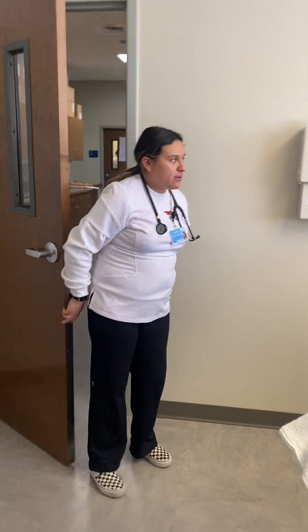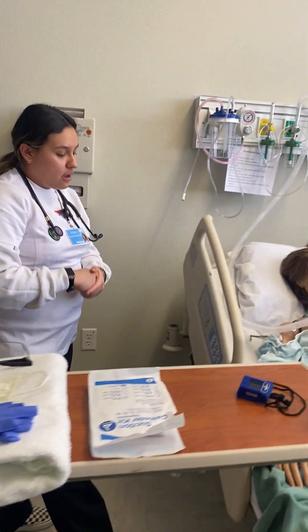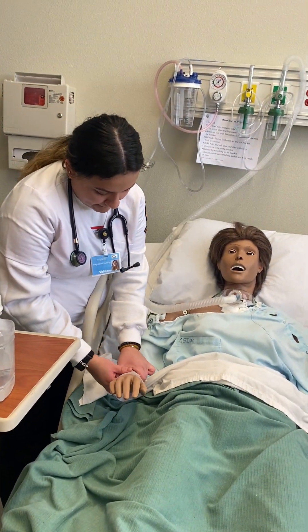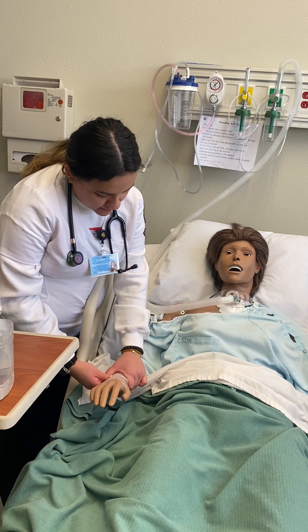Hi, Mrs. Smith. My name is Virian. I'm going to be your nurse for today. I'm going to go ahead and sanitize my hands, perform some hand hygiene. So before I proceed, I just want you to give me your name and date of birth. Jackie Smith, October 9th, 1952.